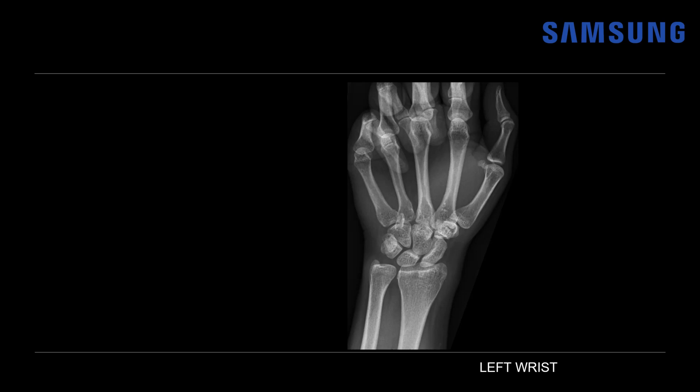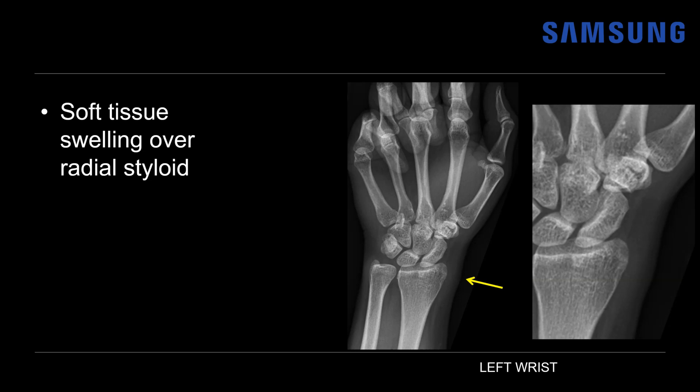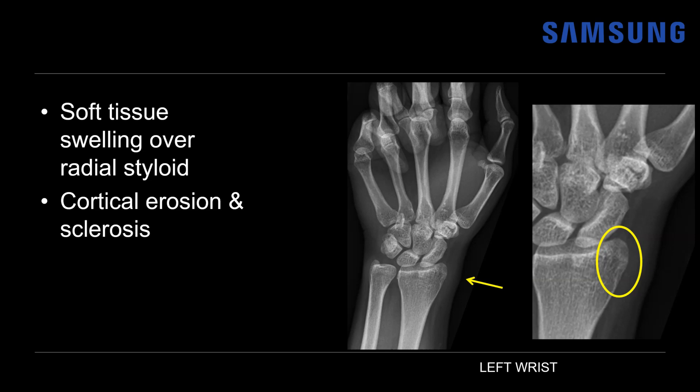Let's look at case two. This was a female in her late 20s who presented with left wrist and thumb pain that began during the late stages of her pregnancy. Starting with an X-ray of the left wrist, there's very subtle soft tissue swelling over the radial styloid, similar to the prior case. Coning in further, there's also some subtle cortical erosion — a lucency with surrounding sclerosis — another finding we may see on X-ray as Dequervain's progresses.